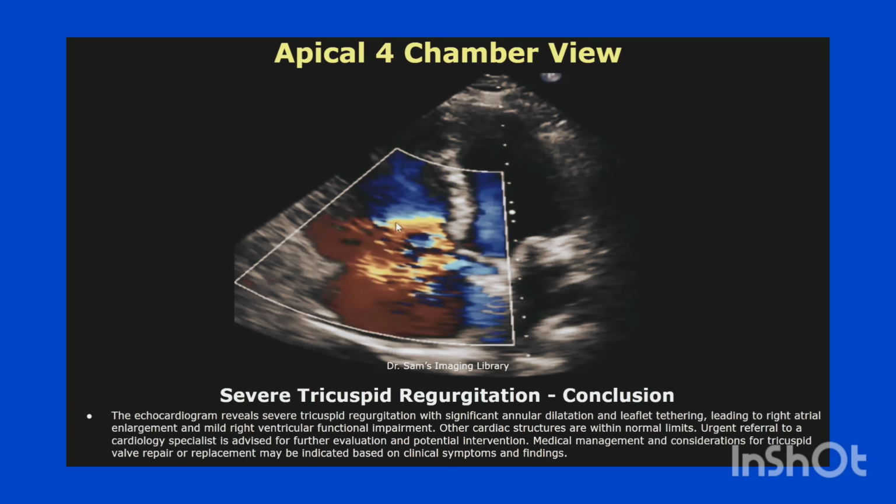Urgent referral to a cardiology specialist is advised for further evaluation and potential intervention. Medical management and considerations for tricuspid valve repair or replacement may be indicated based on clinical symptoms and findings.